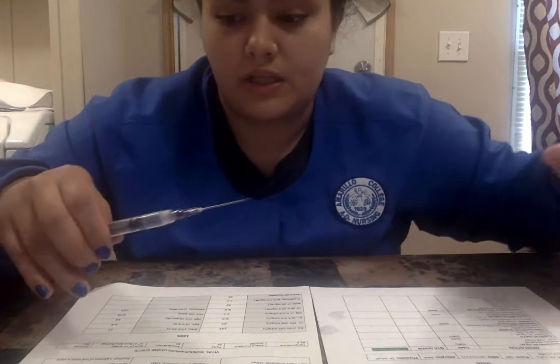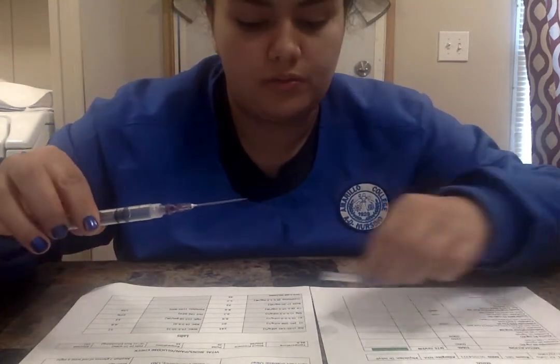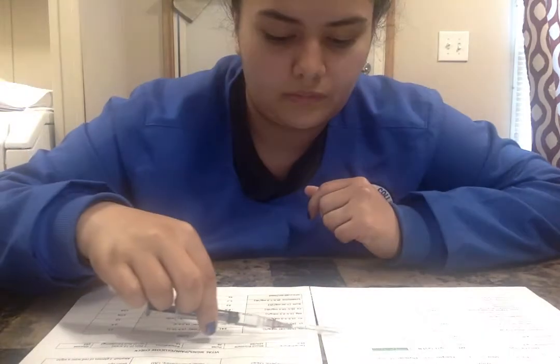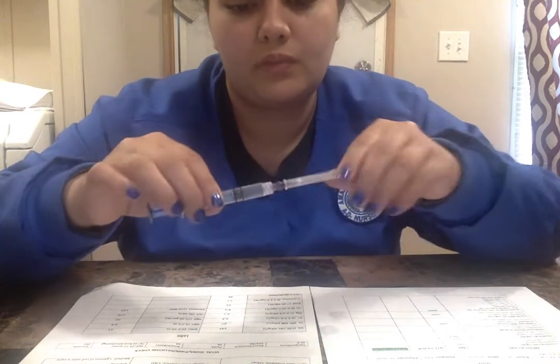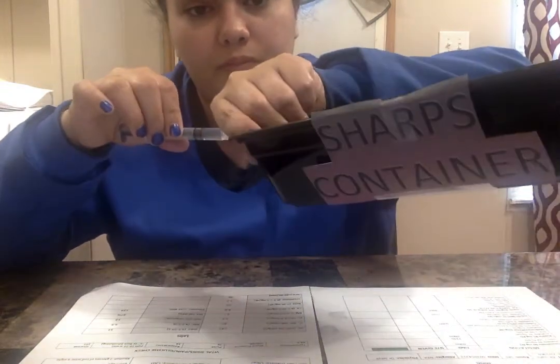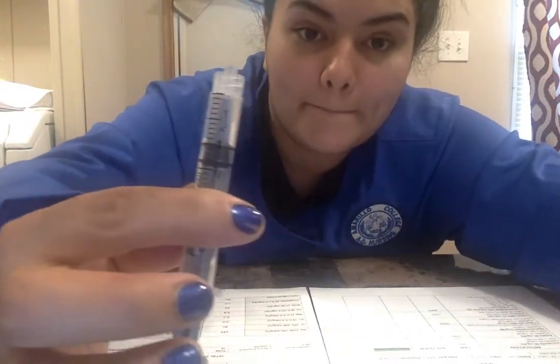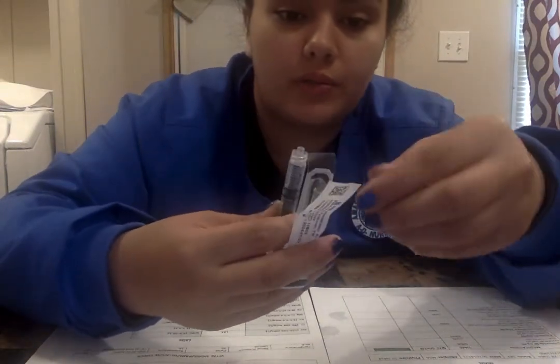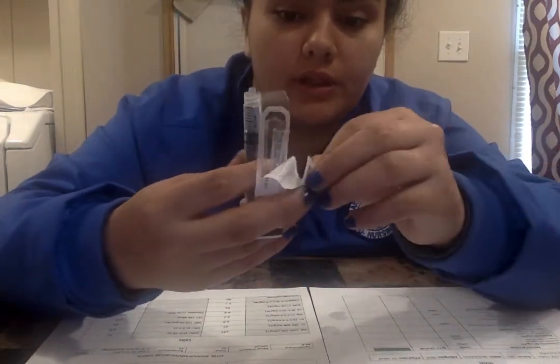Okay, good. So now we're going to recap our filtered needle using the swoop and scoop method. We're going to throw this in the sharps container, and I'm going to show you that it is 1 milliliter. Next, what we're going to do is we're going to grab our 22 gauge, and we are going to open this without contamination.